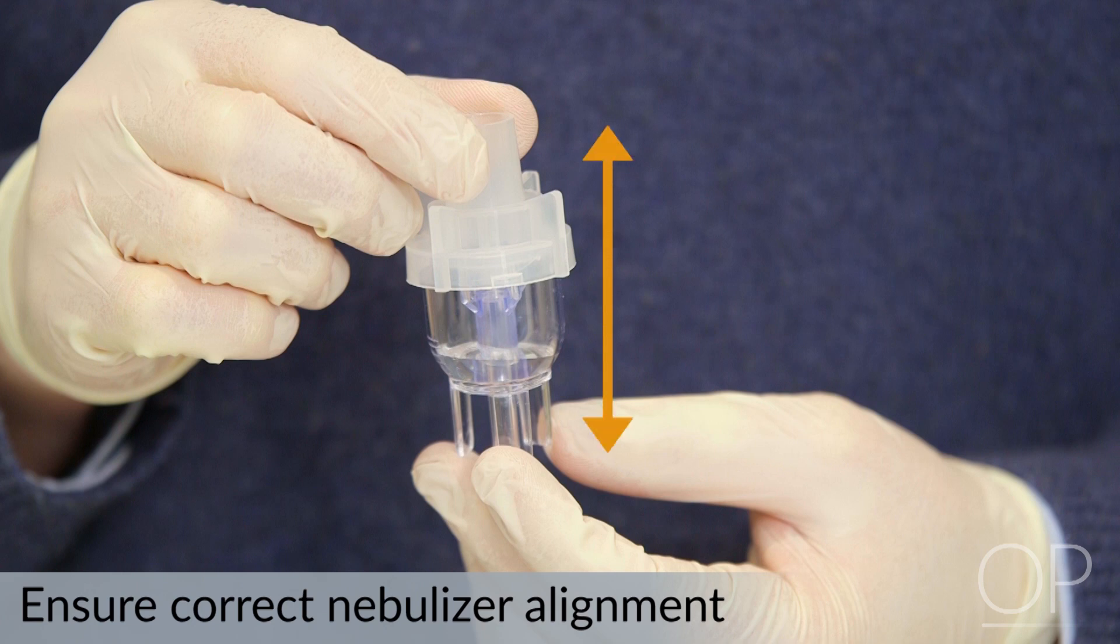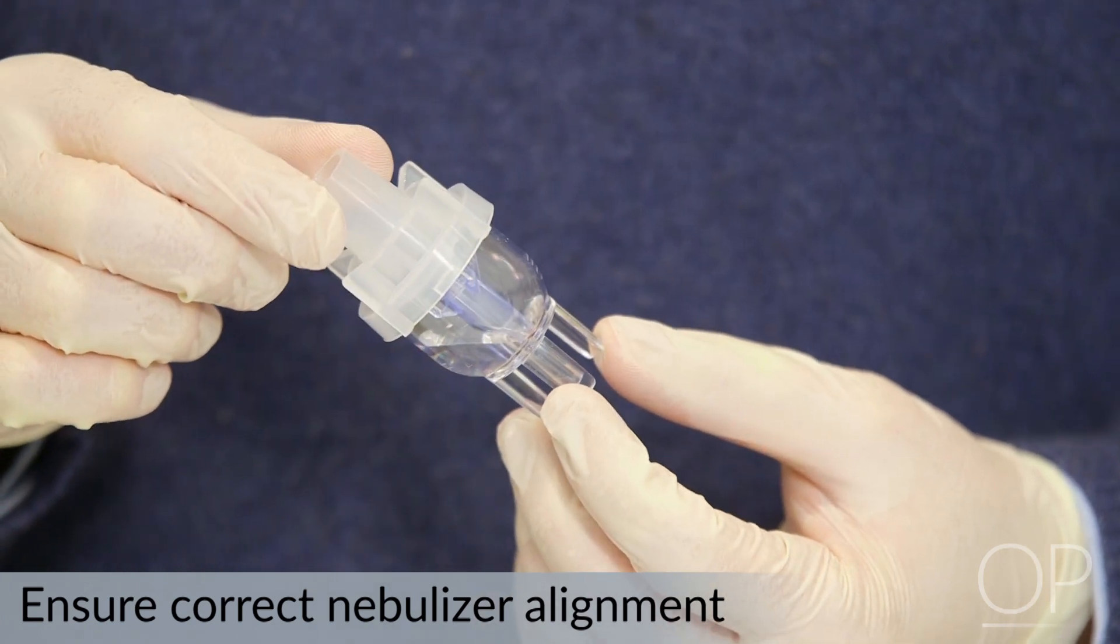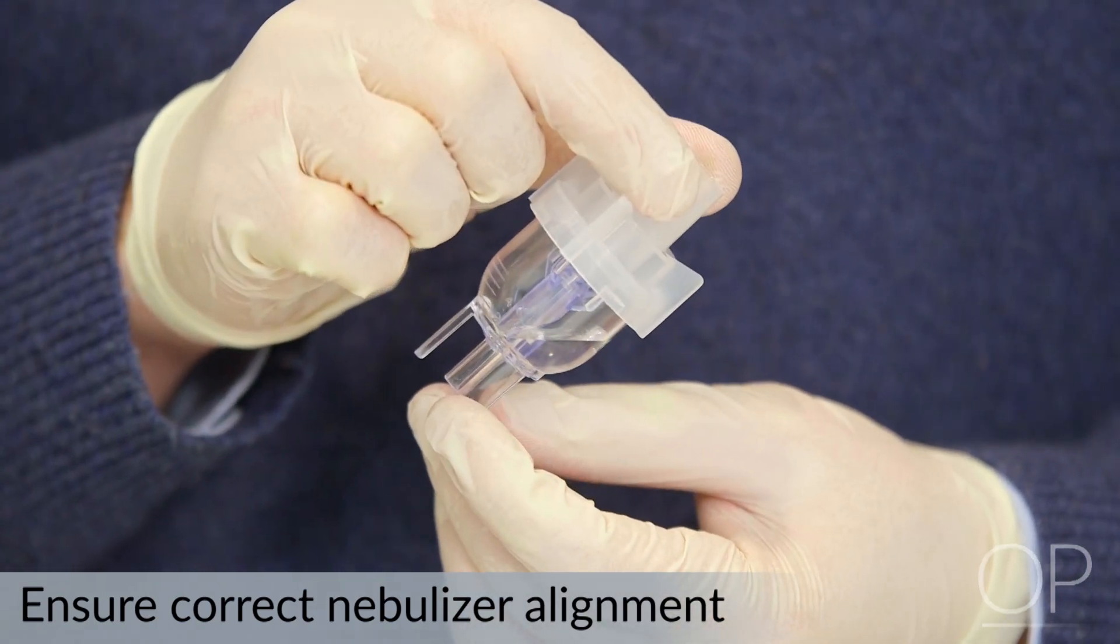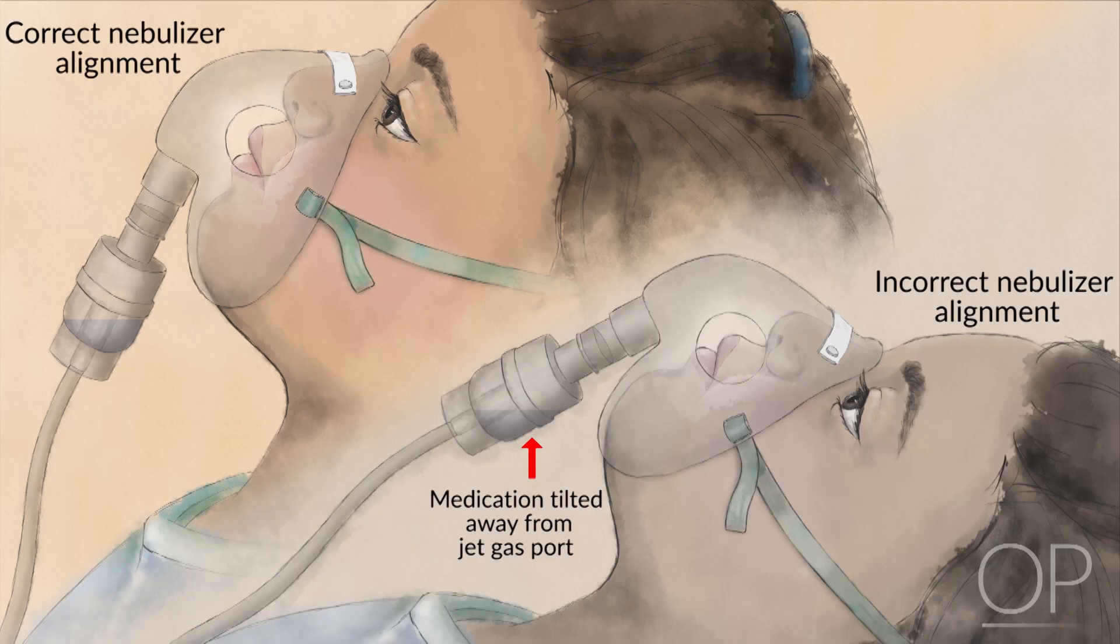An important performance note about jet nebulizers is that they should be oriented approximately vertically to work effectively. Tilting the device too far, perhaps 20 to 30 degrees in any direction, can cause the medication to move away from the jet gas port inside the device and render the treatment ineffective. If you notice a treatment is taking a long period of time or there doesn't appear to be an appropriate volume of aerosol generated, you may want to check the nebulizer to ensure proper vertical orientation.